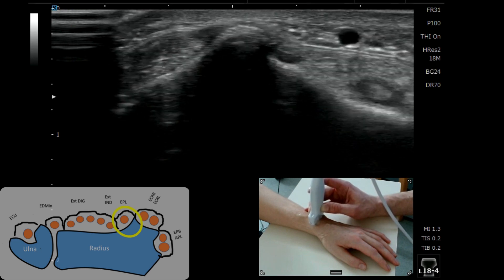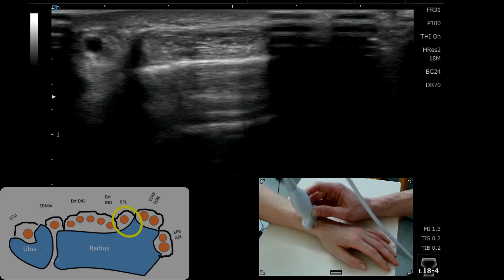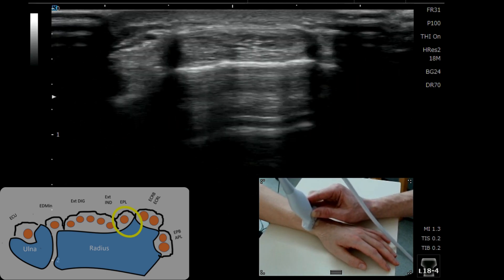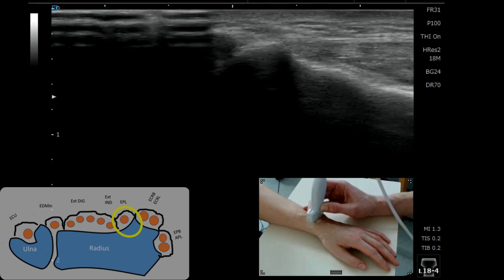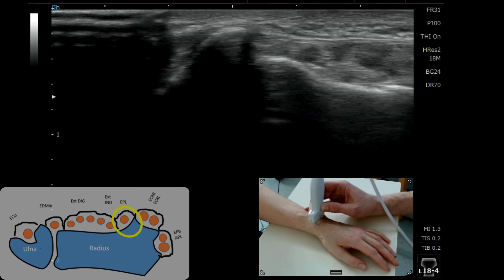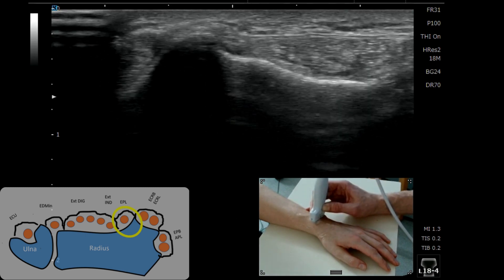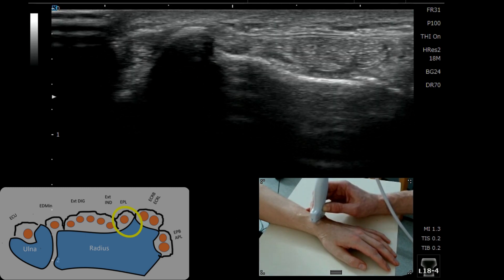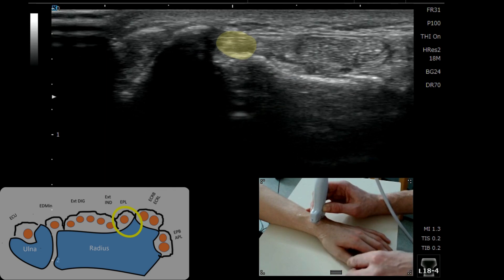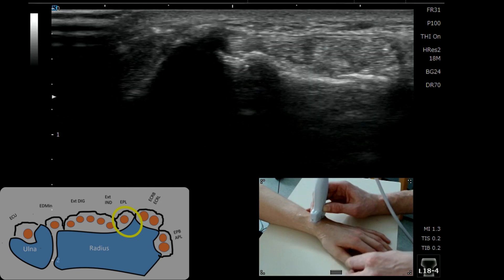We then know from that landmark that we can go back to the distinct appearance of the second compartment with ECRB and ECRL. We go back to Lister's, very nicely visible there, and then we can drop one more little bit over towards the ulnar aspect, and we can see in that little dip we've got EPL.